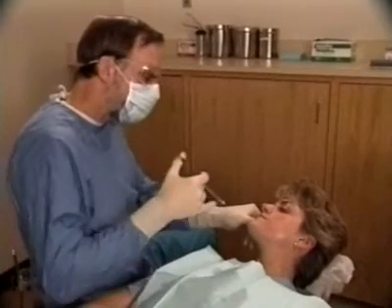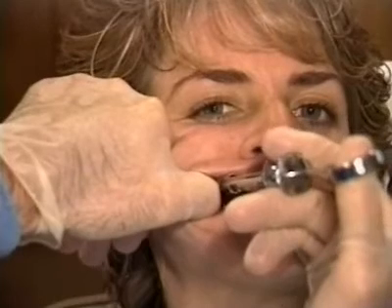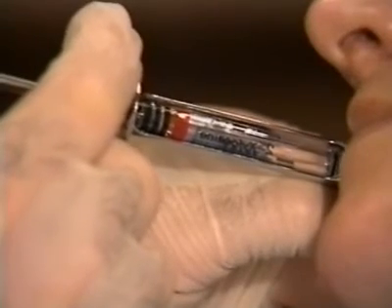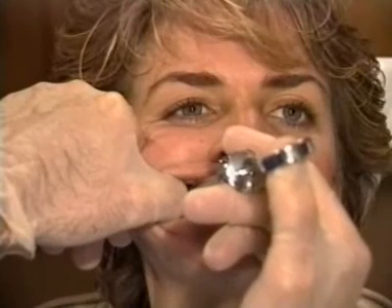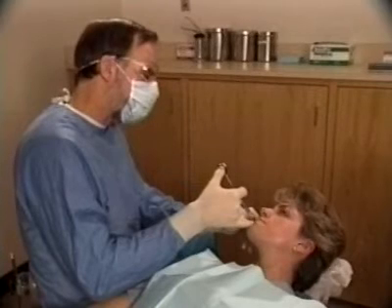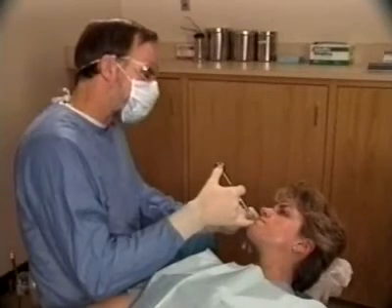With the syringe parallel to the occlusal plane, the needle is inserted posteriorly through the mucosa and buccinator muscle and into the pterygomandibular space. As the needle is slowly advanced to its ultimate depth of 2.5 centimeters, a few drops of anesthetic can be administered to reduce discomfort during insertion.